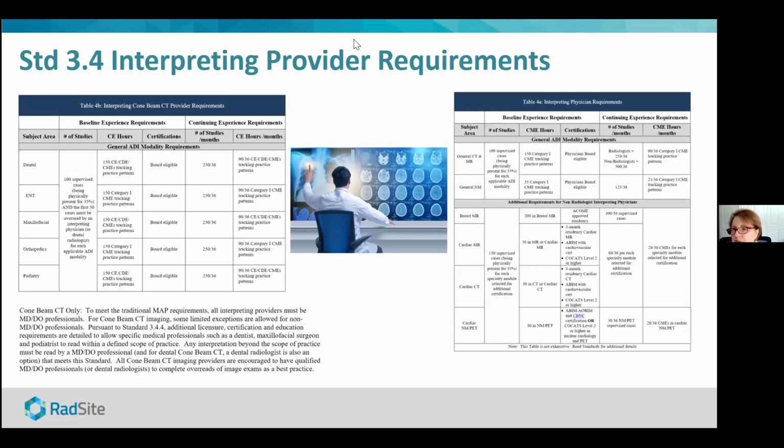Well, one thing just to put in there, Dr. Eliot, in my book, I have a template. So they can follow that template to make sure they document every single area that is on that CBCT scan, so they are writing the report that's needed. And then maybe if they don't know what to write, for example, in the cervical spine, because that's not something they do normally, then that's when they can contact a doctor that is doing it, a radiologist, so that they become more familiar with the areas they don't know how to read.